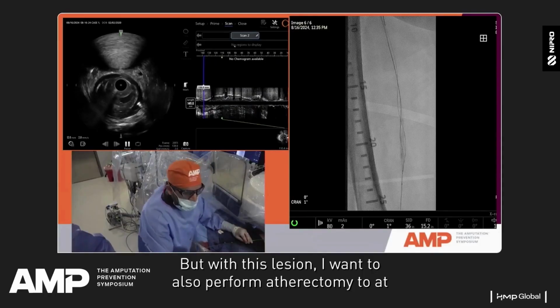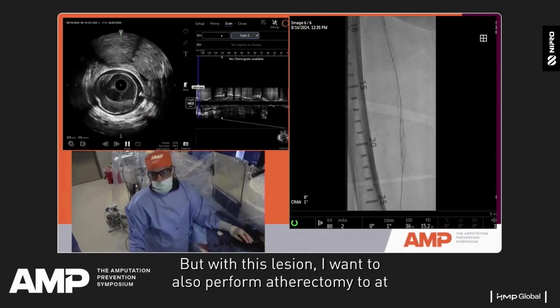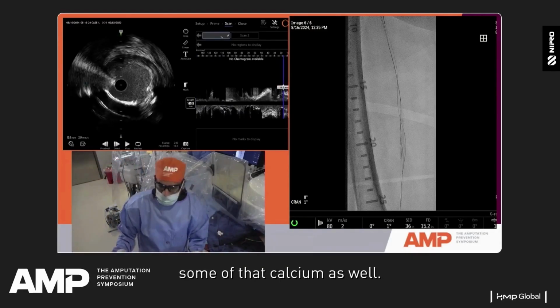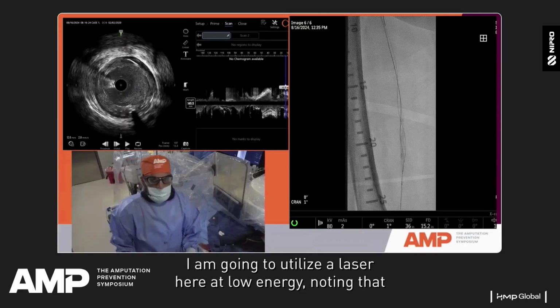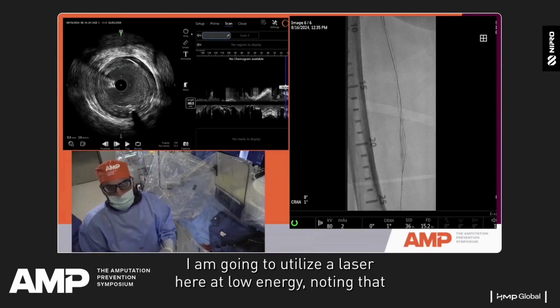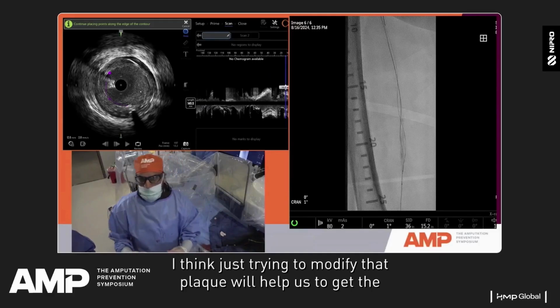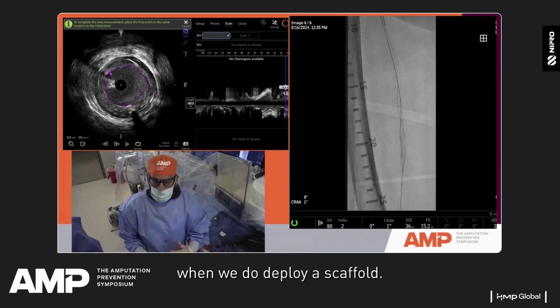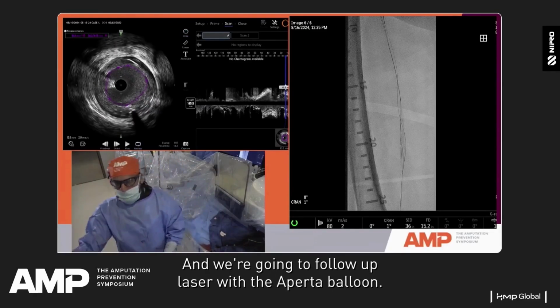But with this lesion, I want to also perform atherectomy to at least modify some of that calcium as well. I think it'll give us our best chance for success. I am going to utilize a laser here at low energy, noting that I am subintimal. I think just trying to modify that plaque will help us to get the best result possible when we do deploy a scaffold. And we're going to follow up laser with the Aperta balloon.